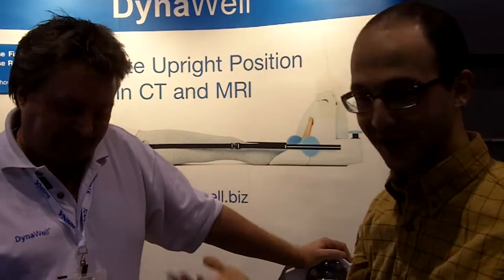Hi, this is Dan from MedGadget at RSNA in Chicago, and today we're talking to Peter from Dynawell, who's going to talk about his system for simulating standing in a supine MRI.